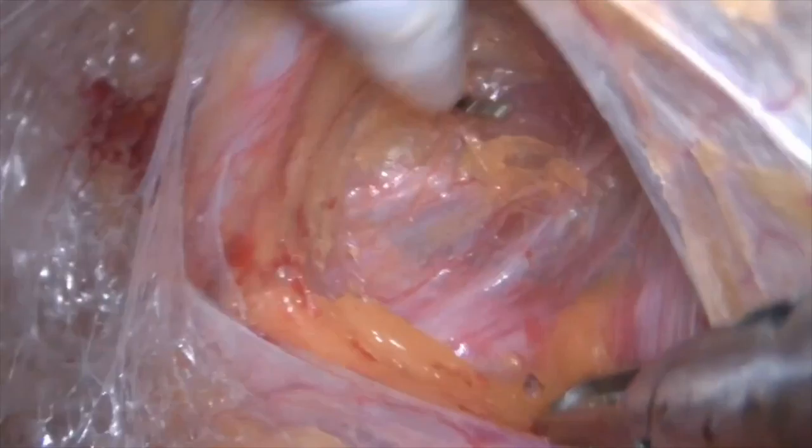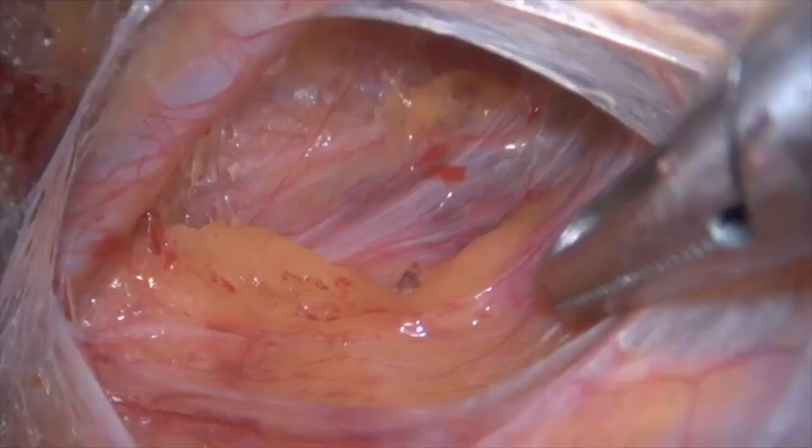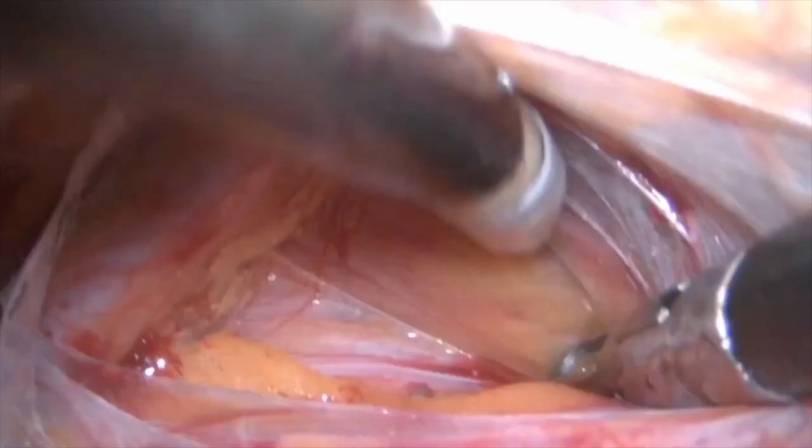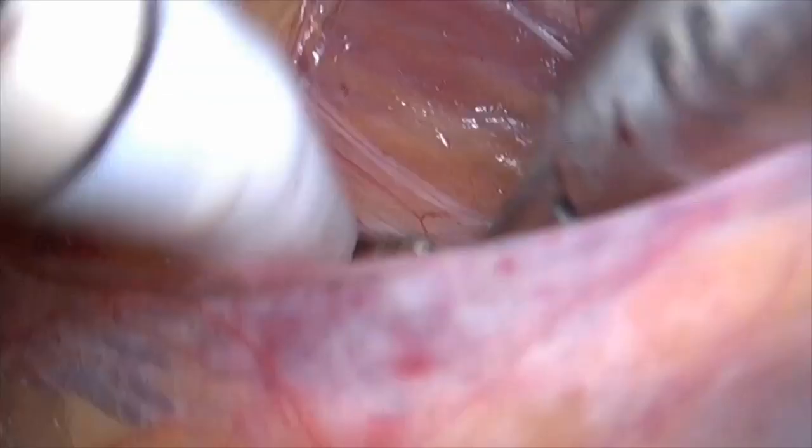You can see now the Bogros space is becoming more pronounced, and gradually we are still going in and opening up the space. You can see I've already identified the edge of the peritoneum, and we are still opening up and widening the space. So that once the space is wide, then we can come to do the dissection. So now we have deployed the mesh, and you can see the amount of space which is available in an e-TEP repair. The rest of the dissection is similar to TEP repairs.